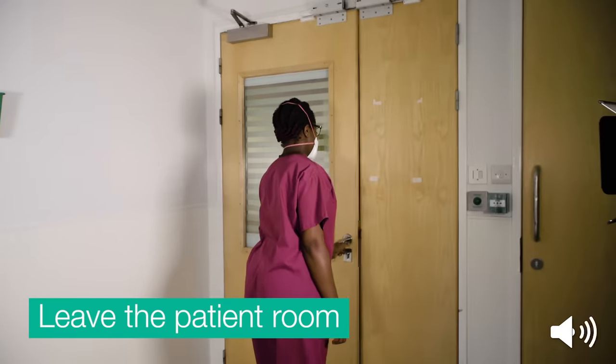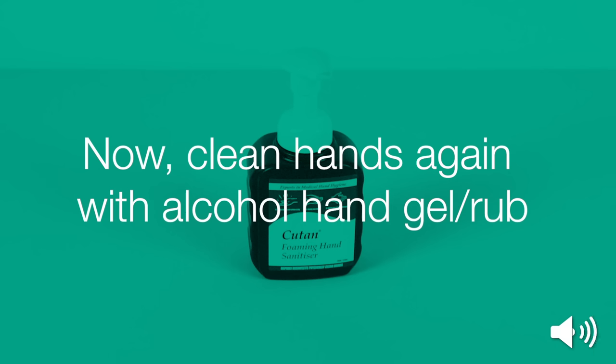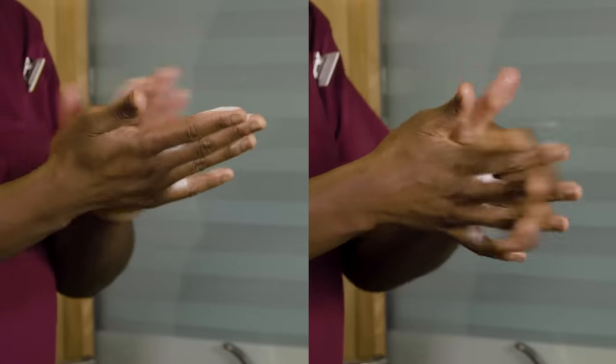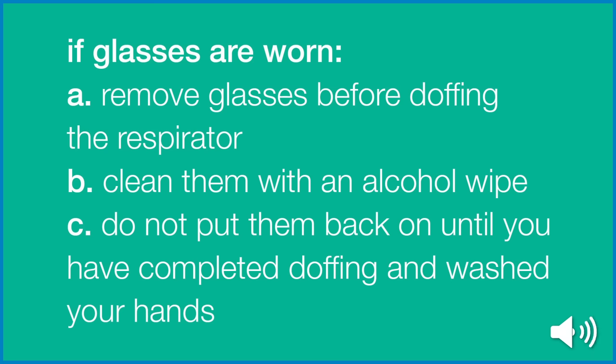Now leave the patient room wearing your respirator. Now clean your hands again with alcohol hand gel or rub. If glasses are worn, remove the glasses before doffing the respirator. Clean them with an alcohol wipe. Do not put them back on until you have completed doffing and washed your hands.